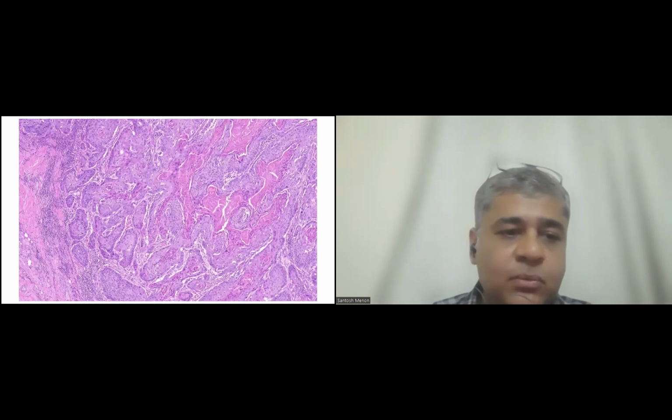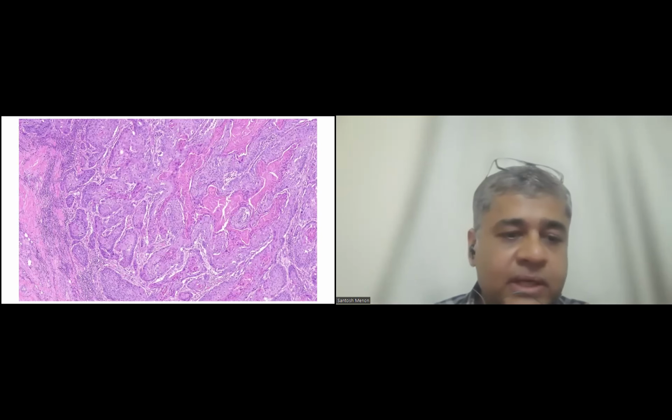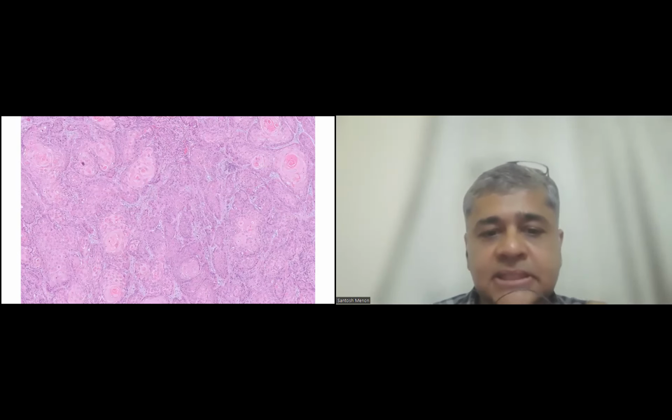Some pictures, every one of you must have seen these keratinizing squamous carcinomas, which are invading the subepithelial tissue, lamina, and the deeper tissues of the penis. Judy has very nicely described this. So these are generally very easily recognized. They can have this intracellular keratinization. They can form good keratin pearls, and these are very easily recognized.